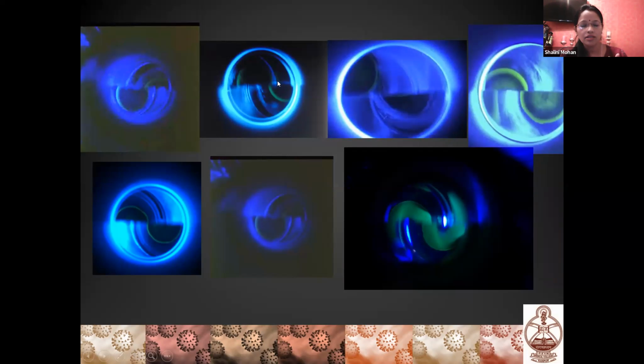There might be a larger circle in the superior hemisphere, or it might be out of your prism, or sometimes the dye would be so less that it is not visible. Sometimes the amount of dye is too much, and we need to wipe it off. So all these images which you are seeing are not ideal, and you will always get an incorrect reading if you get these kinds of mires.